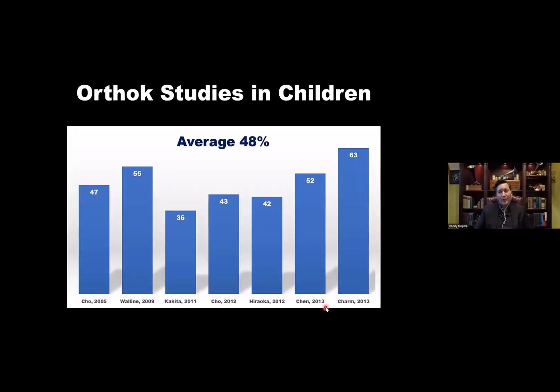Well, if we take conventional Ortho-K lenses and look at all of the peer review studies that were randomized, controlled, we see that we get about 50% less eye growth when we do Ortho-K. Now, that means that the average is 50%, but some patients may get basically no stopping of their axial growth, no hindering or slowing down of that eye growth.